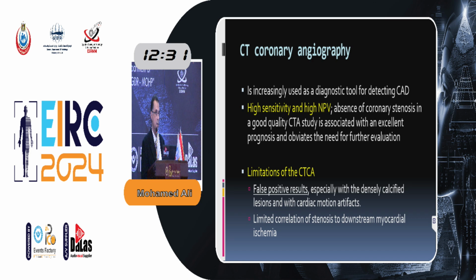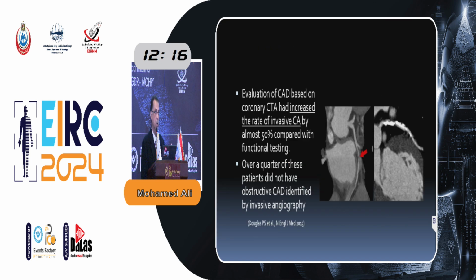However, CT coronary angiography also has its limitations, including the false positive results and the limited correlation between the stenotic lesion and the downstream myocardial ischemia. The false positive results are usually due to dense calcifications and cardiac motion artifacts, and evaluation of coronary artery disease based on coronary CT angiography had increased the rate of invasive coronary angiography by almost 50%.